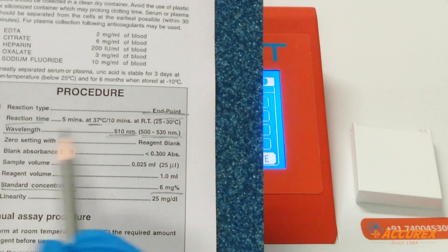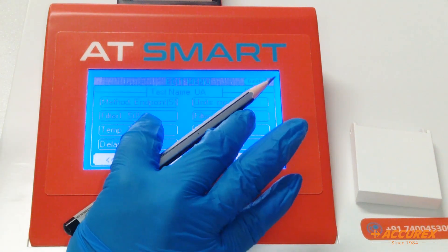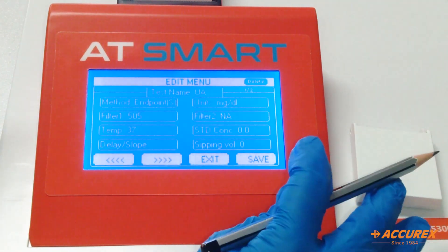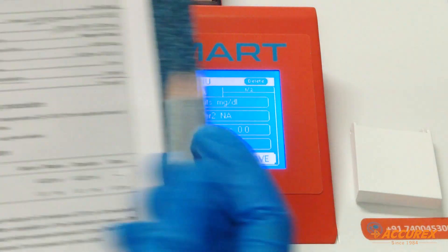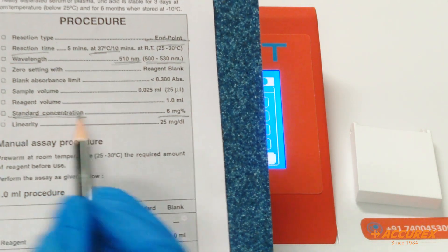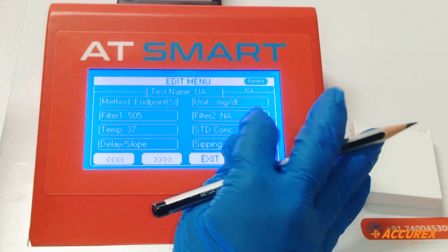Temperature is 37°C, so select 37 and enter. Standard concentration is 6 mg%, so select 6 and save.